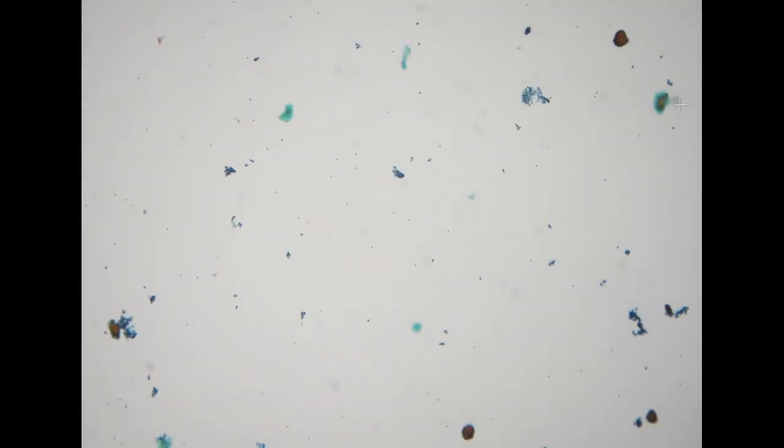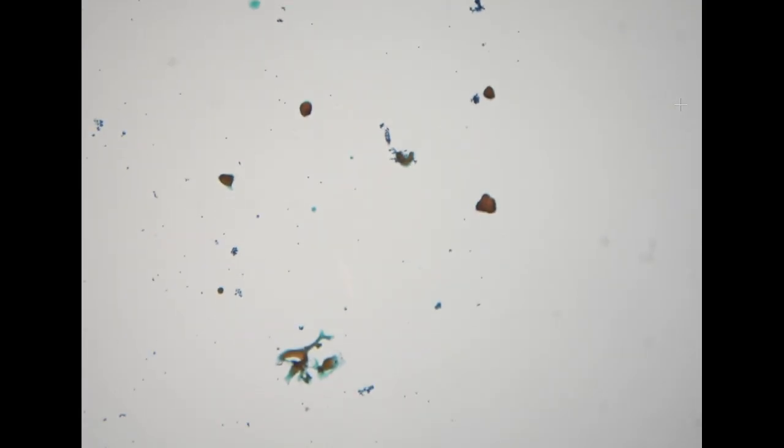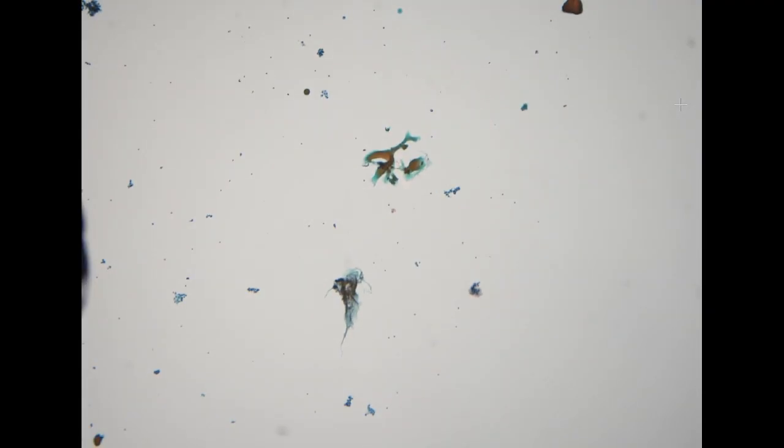Finally, a thyroid fine needle aspiration. On low power, we do see some colloid, but most of the colloid seems to be very dense, thick colloid. But we also see a few thin colloid with more amorphous shape.